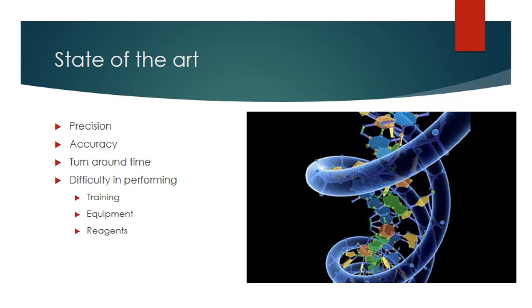The models that we use now with our biochemical testing, we don't necessarily get that kind of security in our identification. Organisms do weird things, and so they may not do something we expect them to do, or vice versa, and that sometimes throws off the reliability of our identifications.